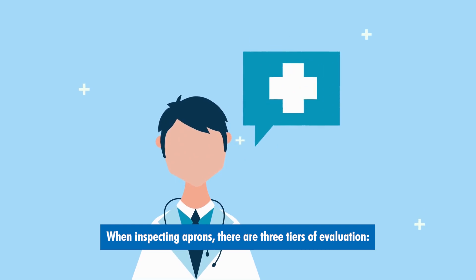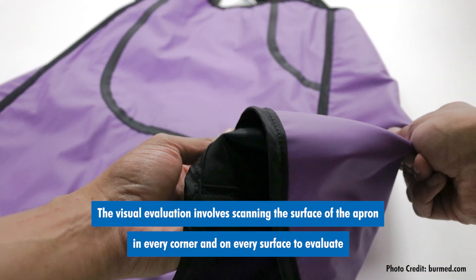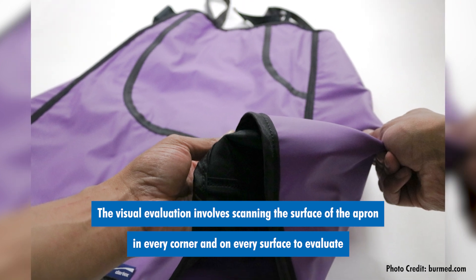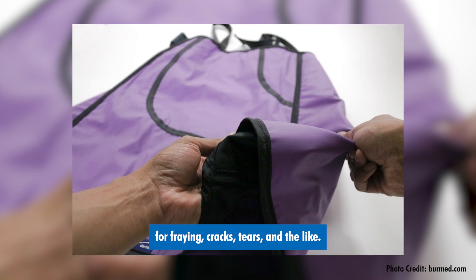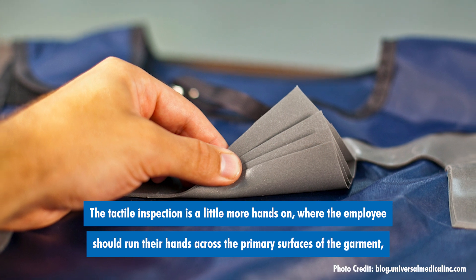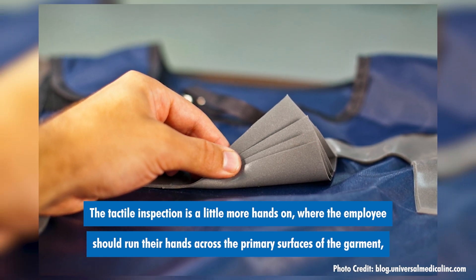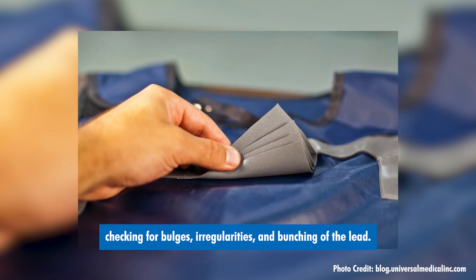When inspecting aprons, there are three tiers of evaluation: visual, tactile, and x-ray. The visual evaluation involves scanning the surface of the apron in every corner and on every surface to evaluate for fraying, cracks, tears, and the like. The tactile inspection is a little more hands-on, where the employee should run their hand across the primary surfaces of the garment, checking for bulges, irregularities, and bunchings of the lead.